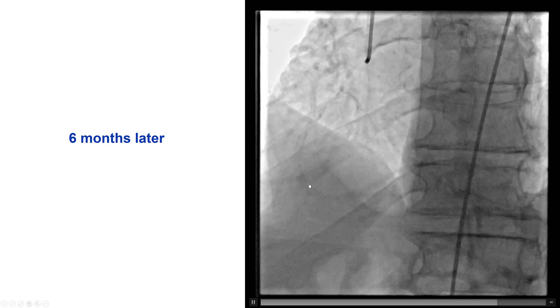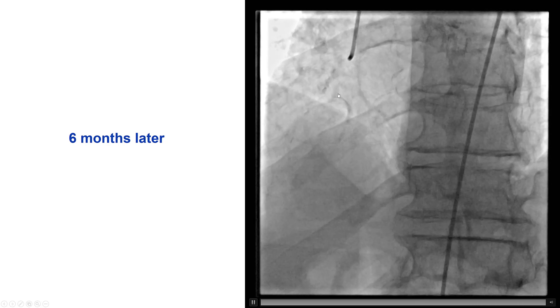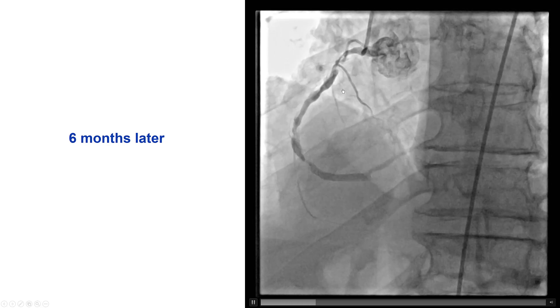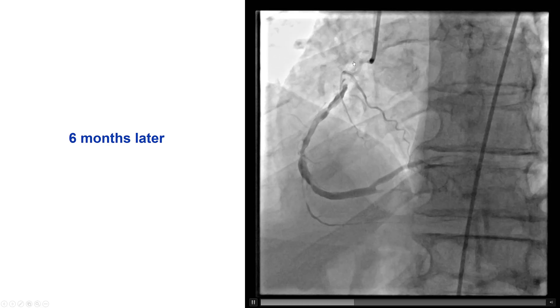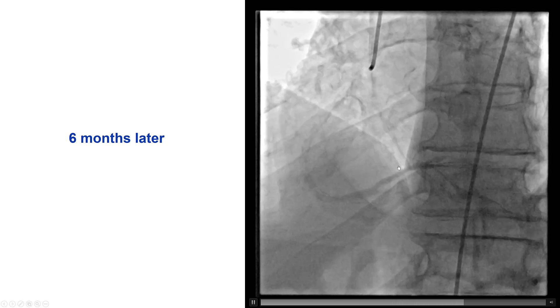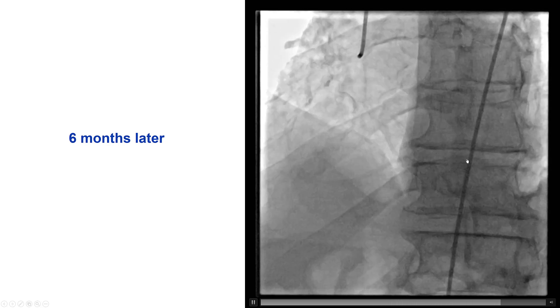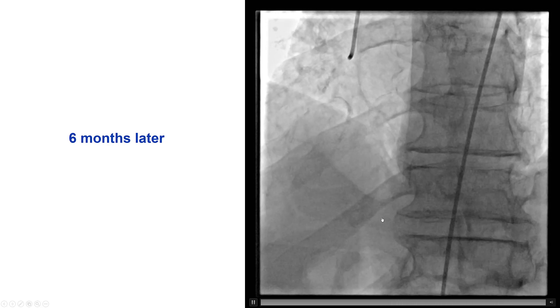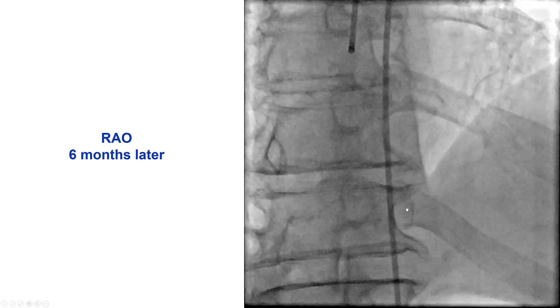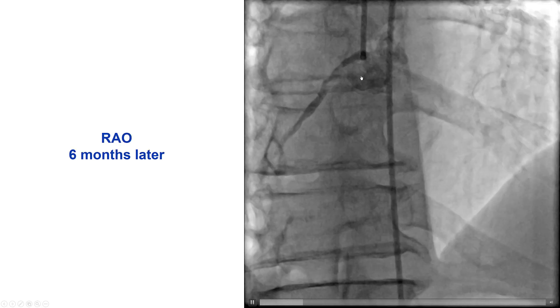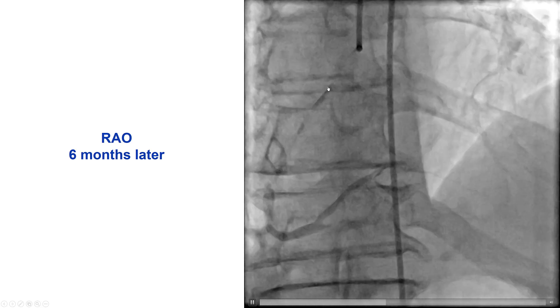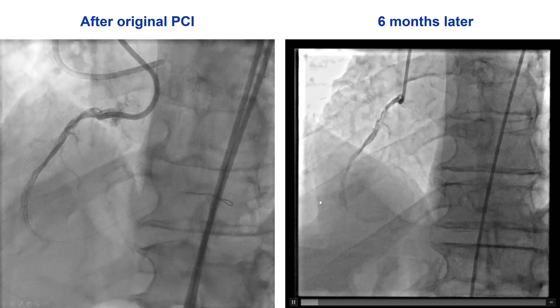There are still some areas of dissection. However, most of the right coronary artery has healed, and there is still good TIMI flow for the RCA and to the posterolateral, with a CTO of the PDA. This is the RAO view, showing that we do have good and great flow.